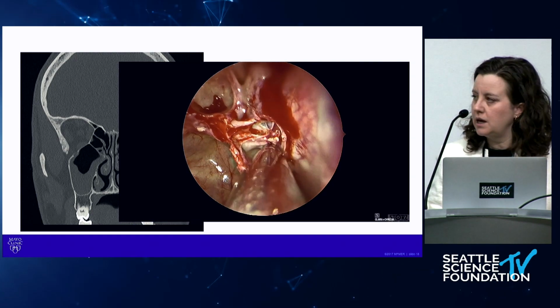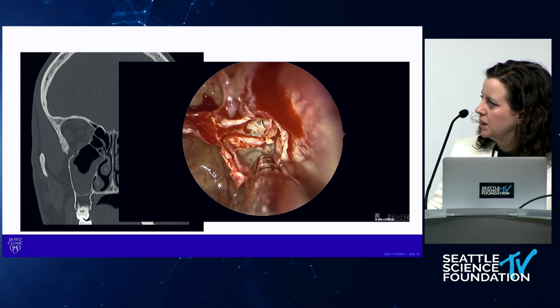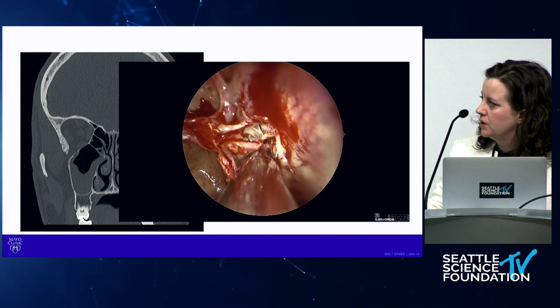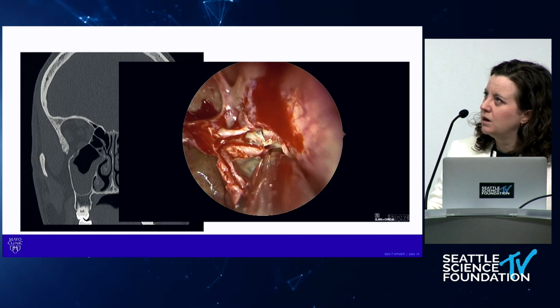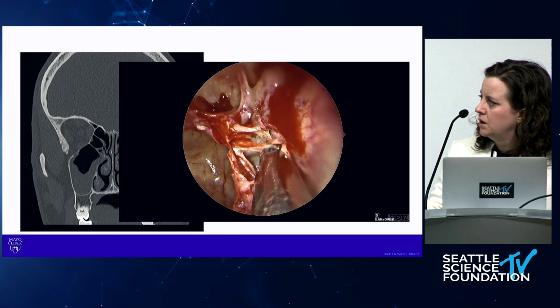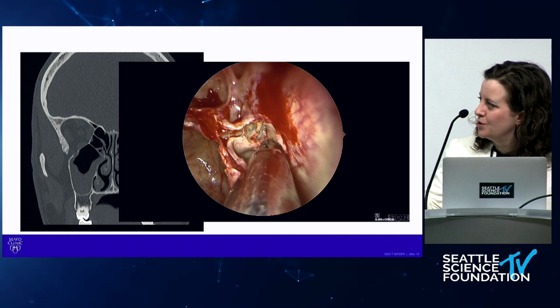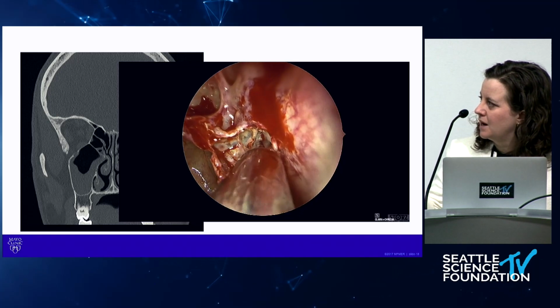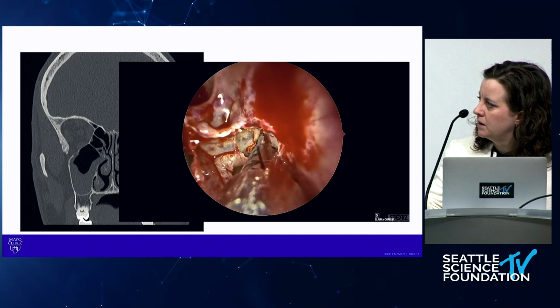We've already taken off the bulla. This is essentially his basal lamella. We're going to come through medial and inferior first. You can go through, we call it the J curette. It's like a straight curette is one way to come through and open this up. Again, your push or your force vector is away from the eye and away from the skull base. We're coming through that basal lamella.